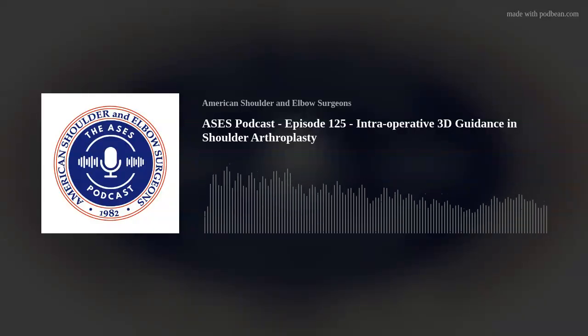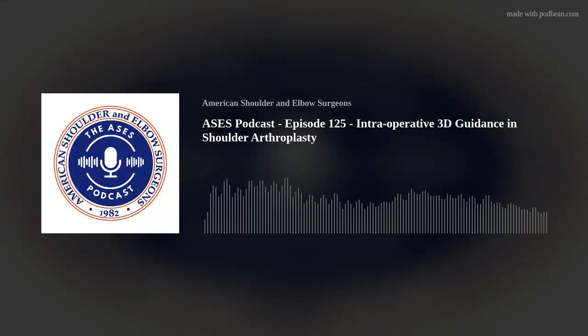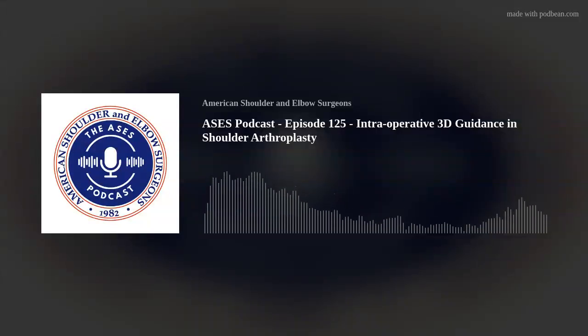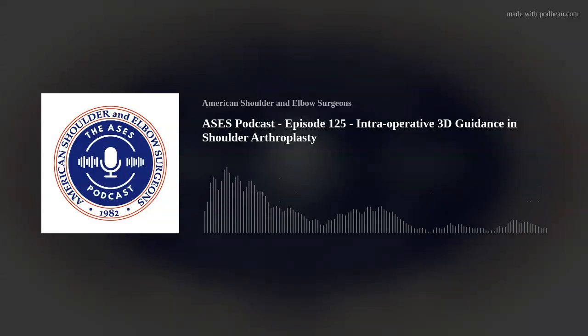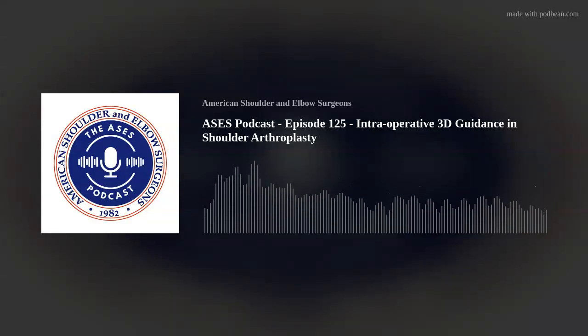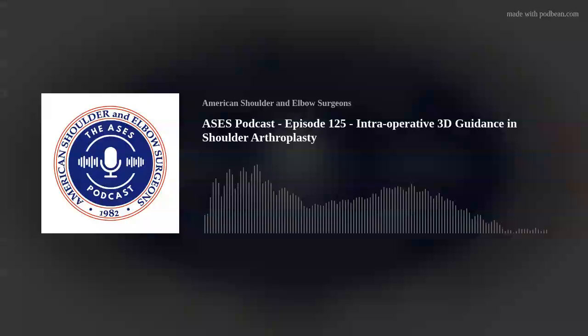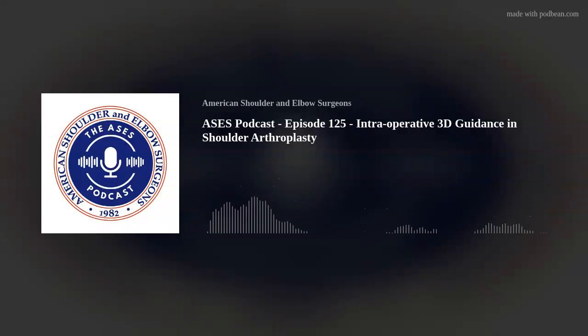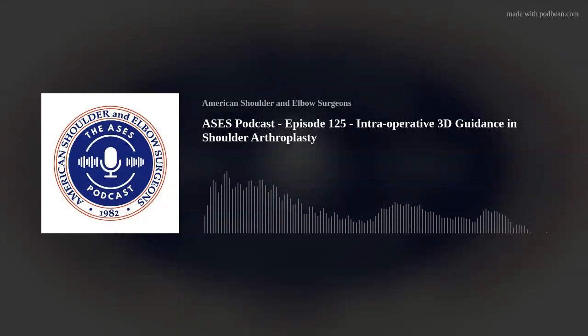Yeah, I mean, certainly on my fellowship group chat, we have these things where an MRI cut will come out and say good enough for an anatomic, and we'll disagree. So I don't think that we as shoulder surgeons know that yet. And it's probably because we don't know what's going to be a symptomatic rotator cuff tear versus a gray-haired rotator cuff tear that's well compensated, that will continue to function very well with an anatomic prosthesis in place. So until we have that figured out, I can't tell you what's clinically significant and what's not purely based on the MRI.